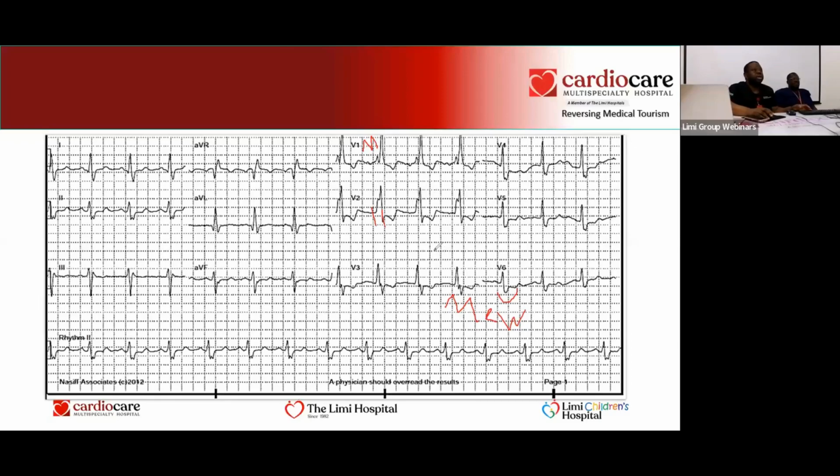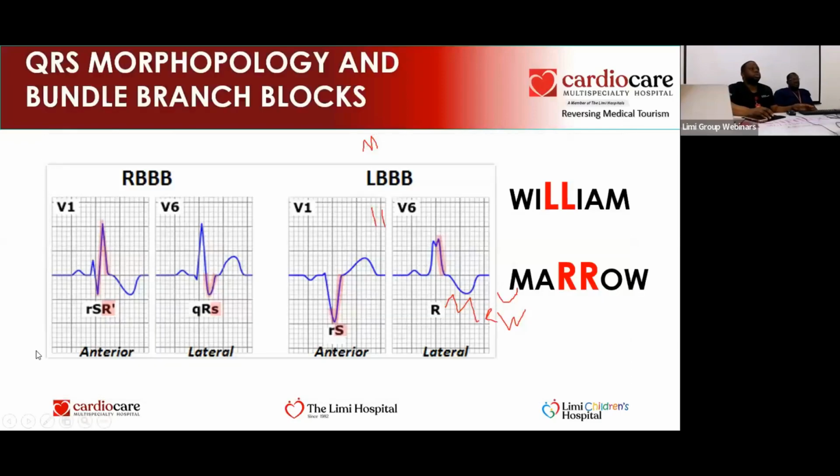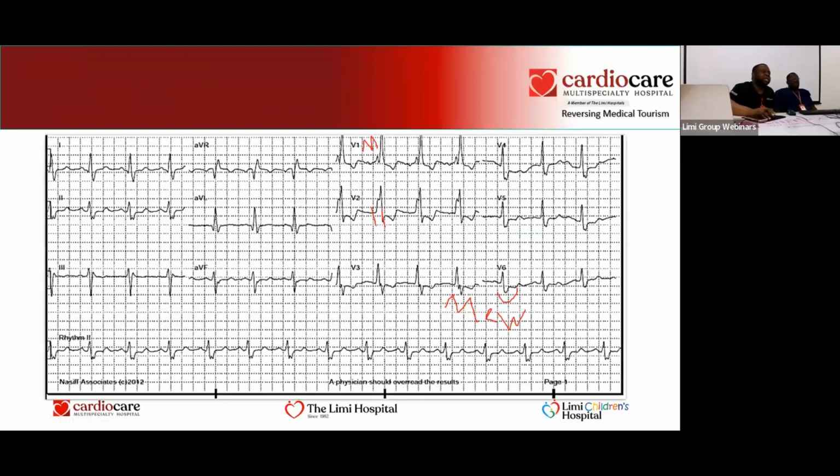Just like we had said earlier. Okay, so right bundle branch block. If you look at this one now, you can see how it is in V1 and in V6. And then we come here and we are seeing exactly that. So I hope that is really clear.